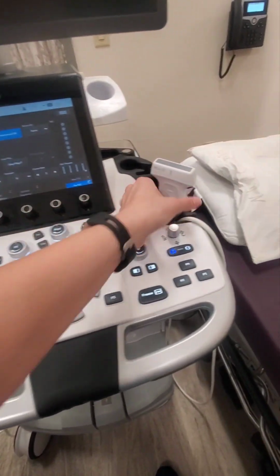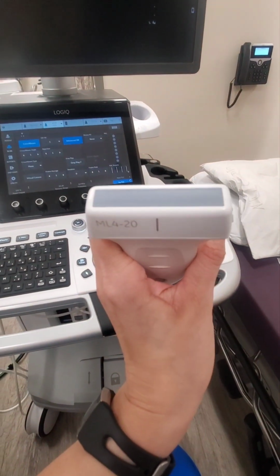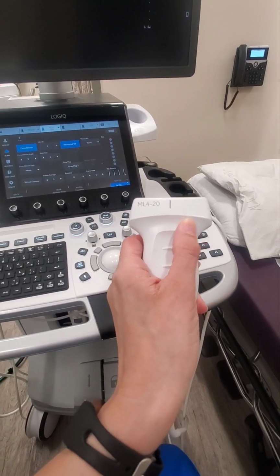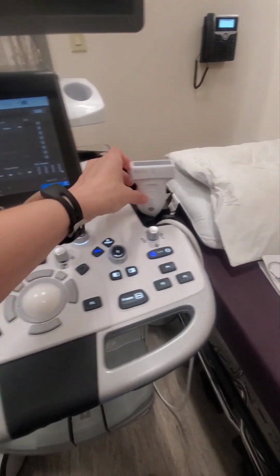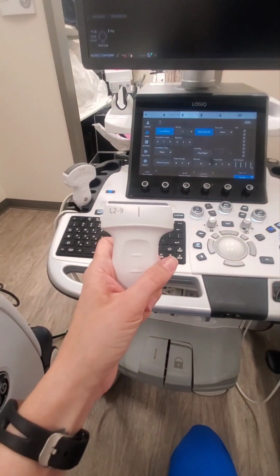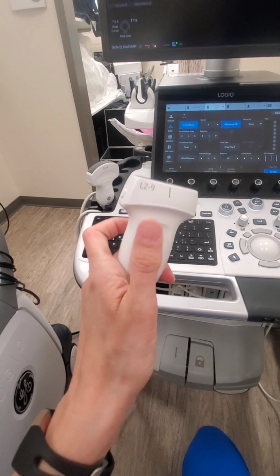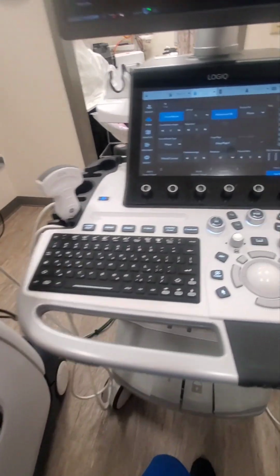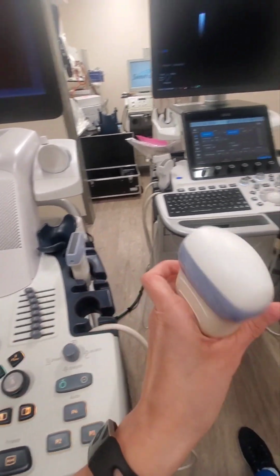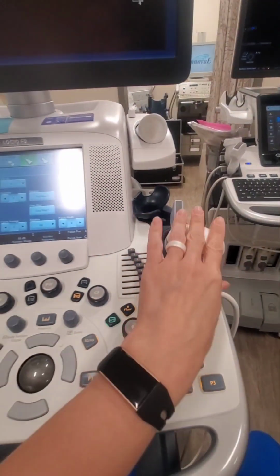Your linears are going to be higher frequency transducers, and these are for more superficial scanning. This is a good one for scanning breasts, scrotum, thyroids, some vascular work. We often use the 9 for vascular scans. So if we're scanning legs, if we're scanning arms, and we're scanning arteries or veins, usually we're scanning with the 9. This is a 3D/4D probe, and I'll explain what that is in a little bit.